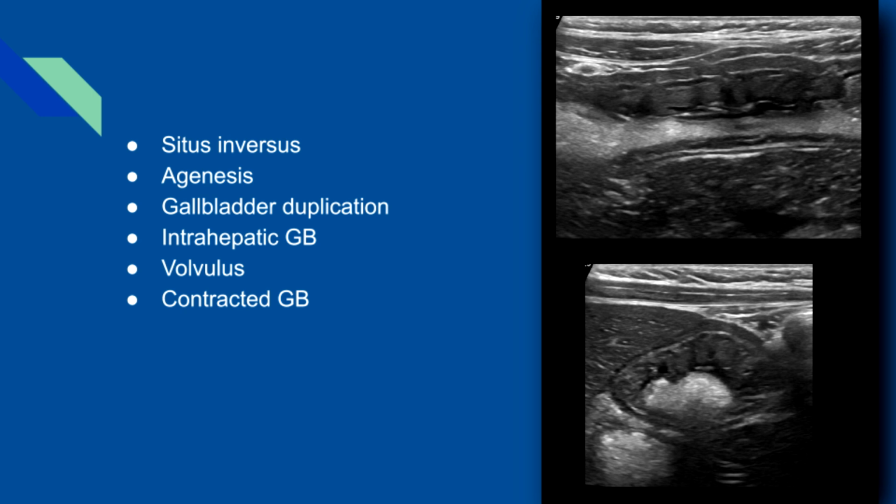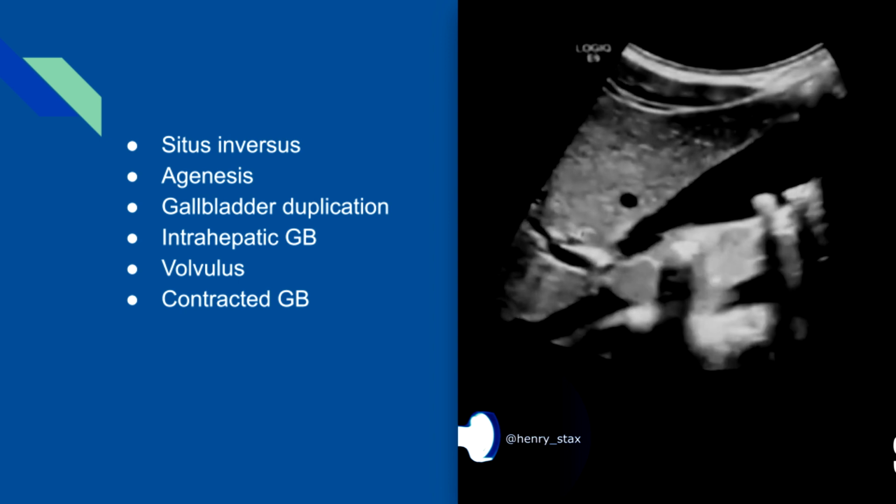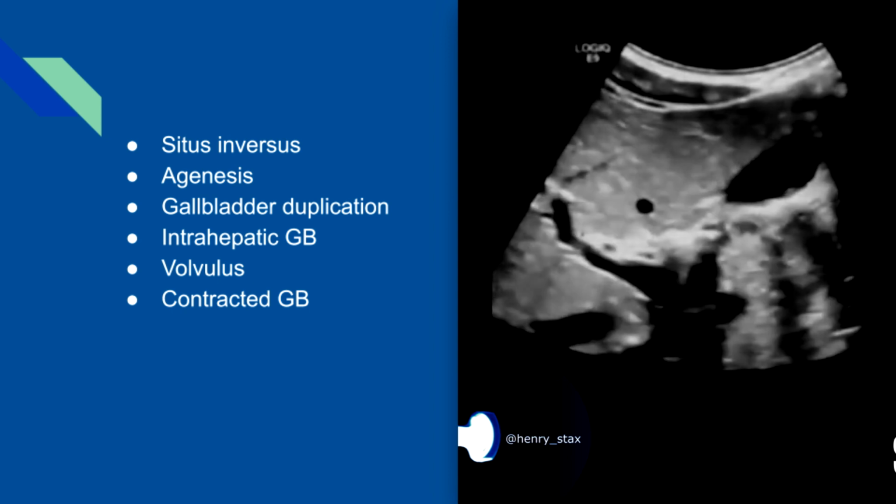Scan the gallbladder in supine, left lateral decubitus for gallstone mobility or to rule out these pitfalls. And you can also scan, I've even scanned the gallbladder upright.